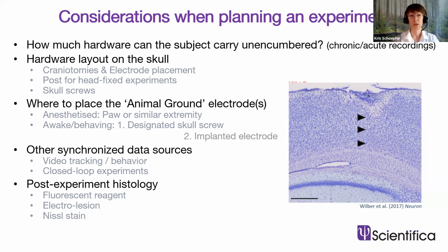Also, for folks who do head-fixed awake behaving experiments, you may need to insert a head-fixed post, essentially, and then skull screws to keep everything stable in place. We don't want any of that equipment coming off of the animal unexpectedly.